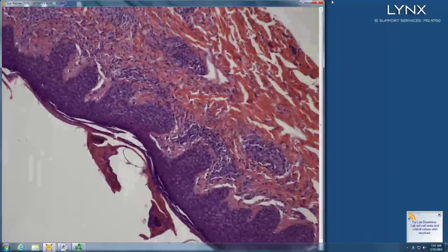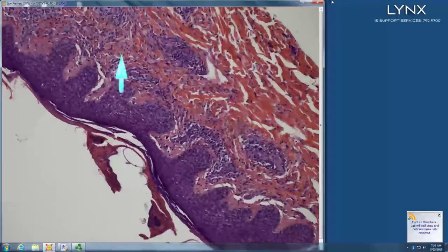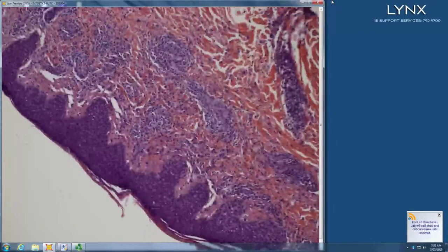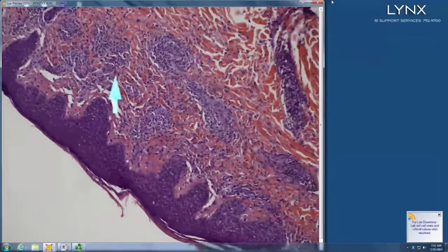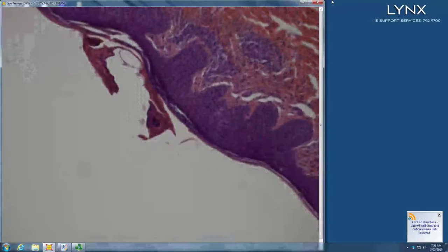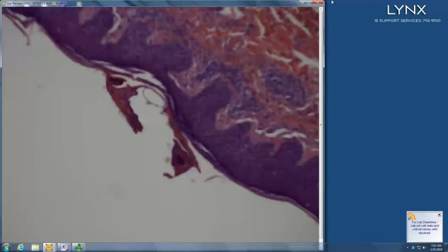So superficial infiltrate. And do you have lumen to your vessels? Or is there endothelial swelling? Really no lumen to the vessels. Lots of EOs. And then any other clues?